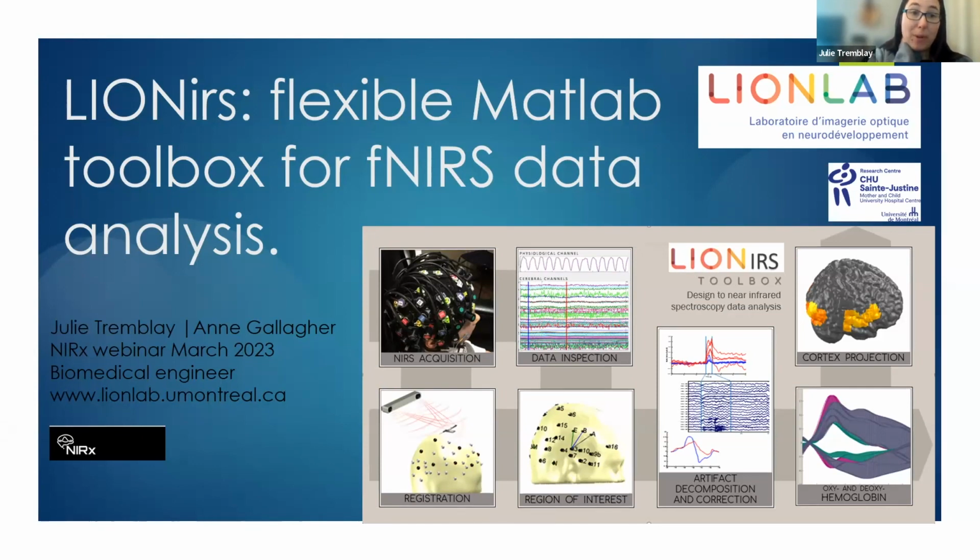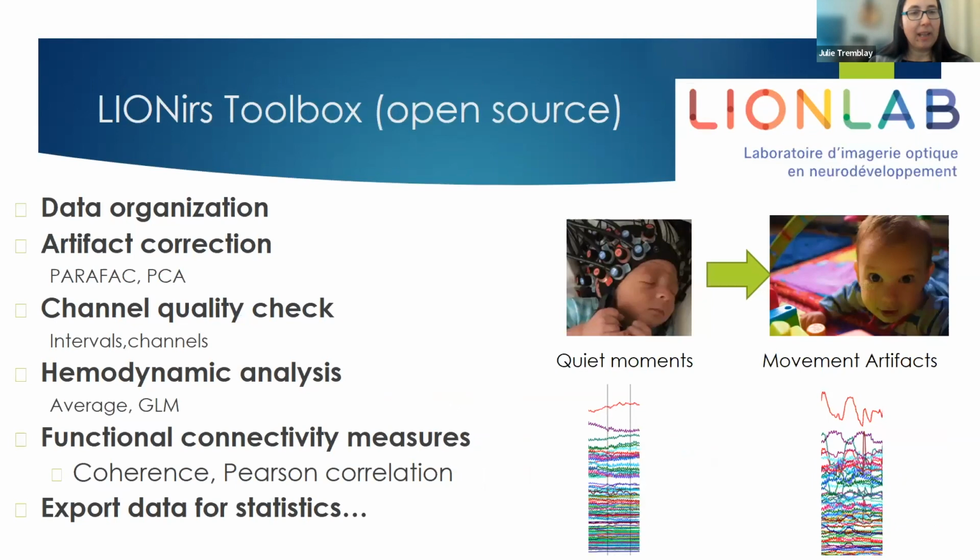We are using near-infrared spectroscopy on many research projects, mostly related to children's development, and some with various neurodevelopmental conditions. This population is challenging to test. So the aim of this toolbox was to give us flexibility in our data analysis, and we are happy to share it with the community. It is now freely available on GitHub.